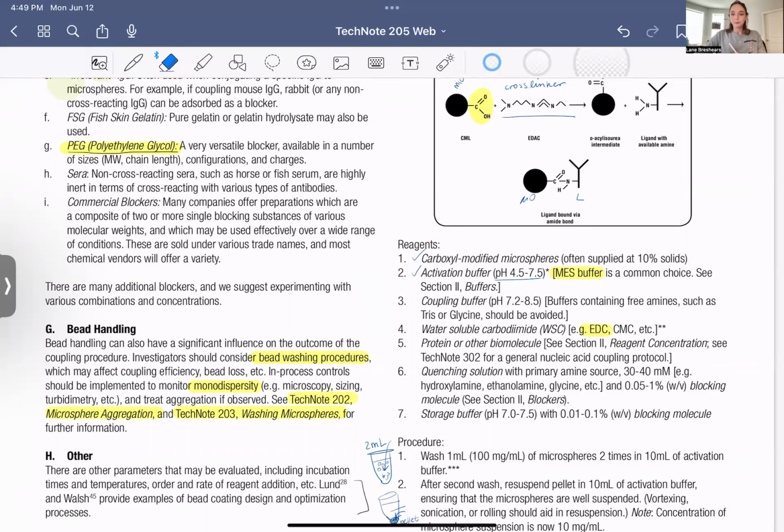This is huge. So, for example, if you have finished your reagent preparation and you're loading it into your immunoassay to look for clumping between the microsphere and antibody to any target antigen, if you haven't washed your microsphere reagent, then there's a very good chance there's already self-aggregation happening in there.